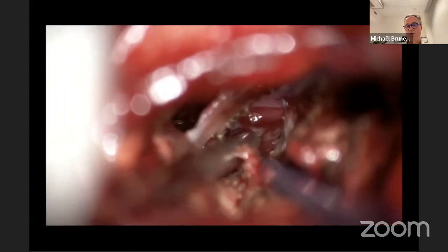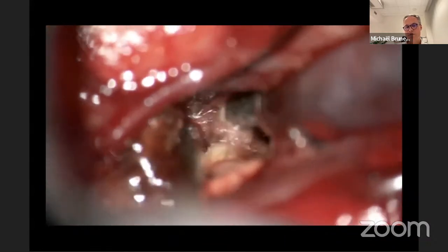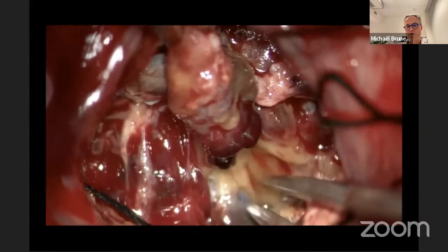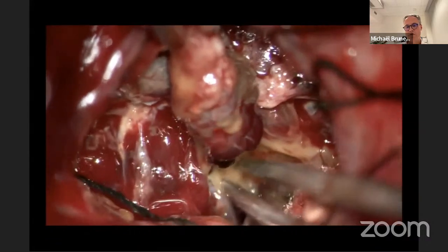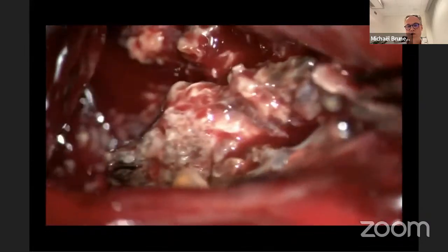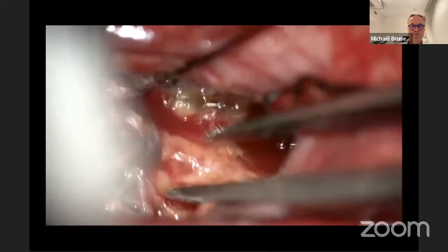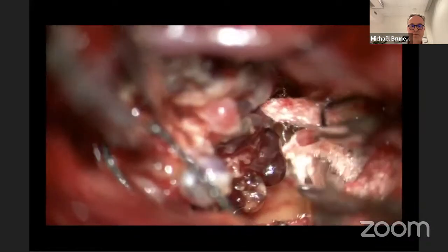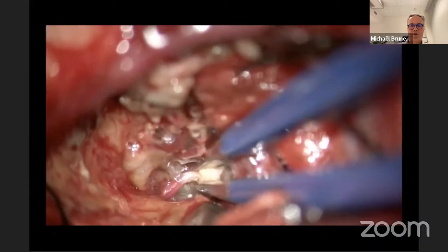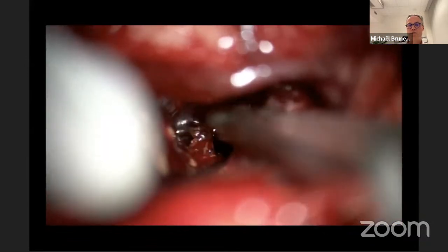The tumor is resected piecemeal, gently debulked, progressively aspirated with the CUSA, dissected in its surrounding. You see the typical aspect of the cavernoma, preservation of some arterial branches. You see how big was the mass of this lesion. And you will see in a few seconds how it is important to coagulate the feeding vessel. In this case, there was 2 feeding vessels.